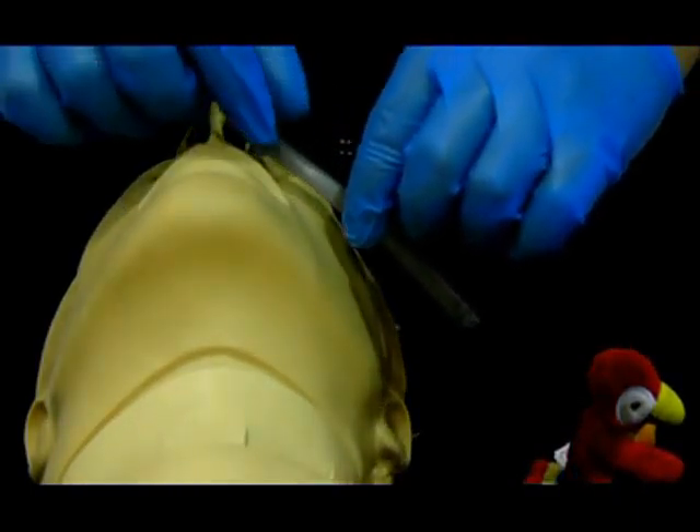Sizing of the NPA: use the largest size that will fit the patient's nostril. Select the correct length, which is from the nostril to the tip of the earlobe.